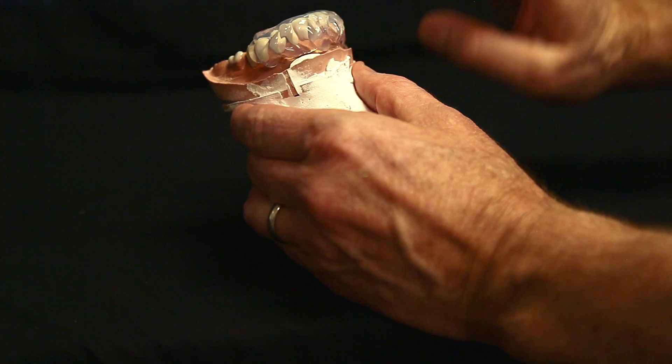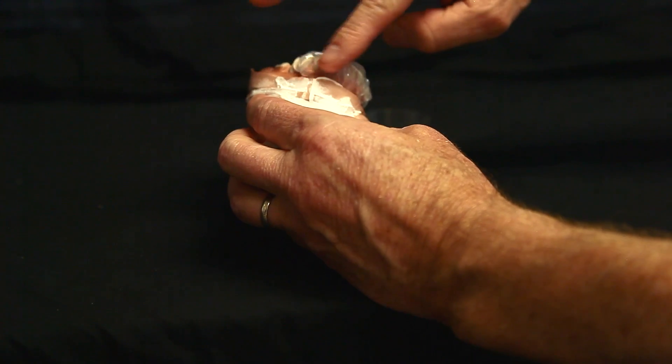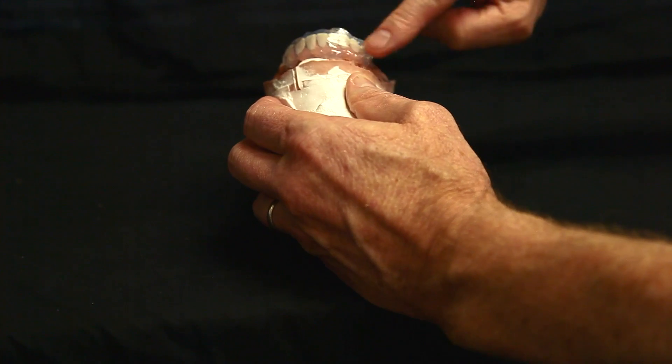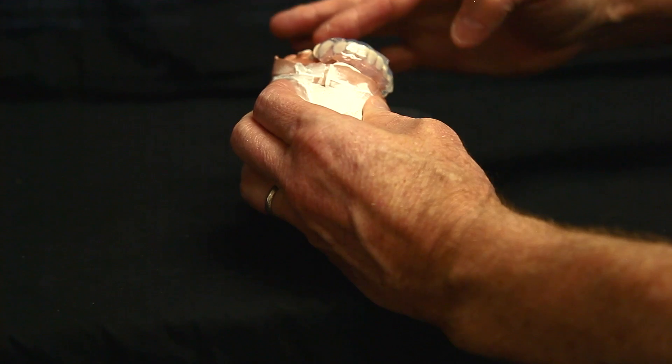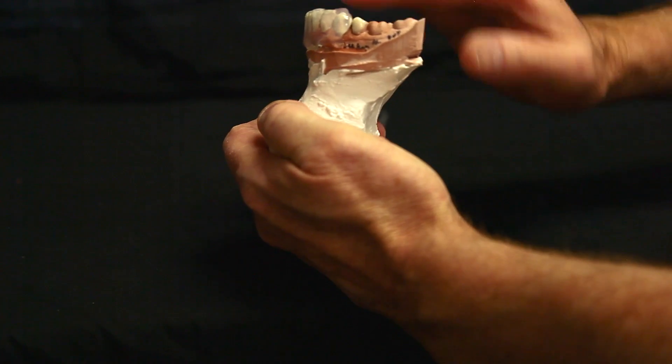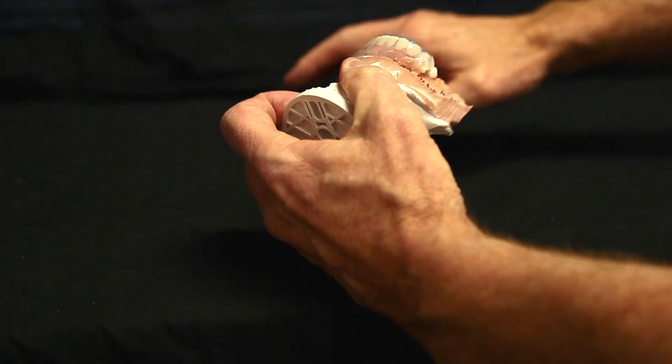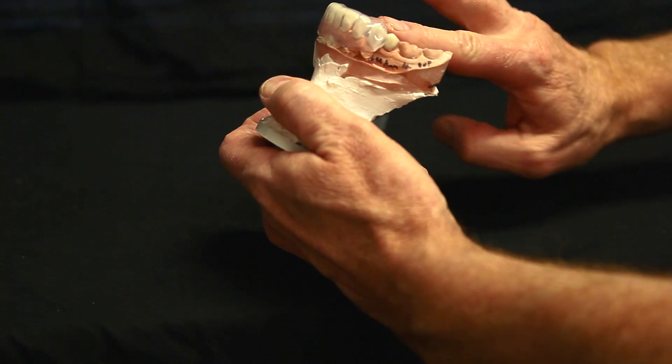And then I just take a little lubricant material here and you're just going to lightly smooth that out. And you want to try to get it so it's a fairly even thickness.